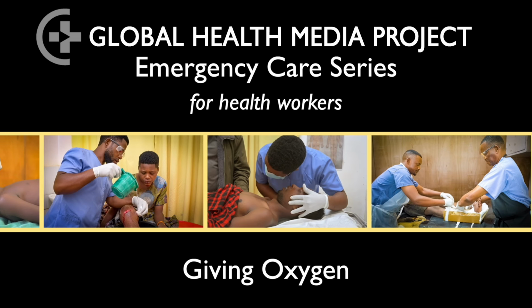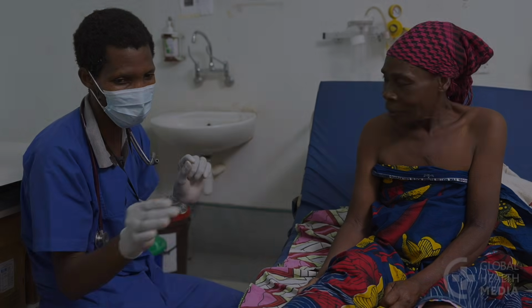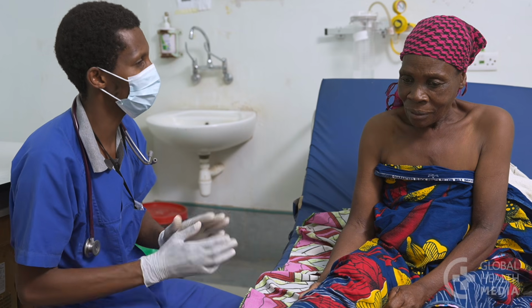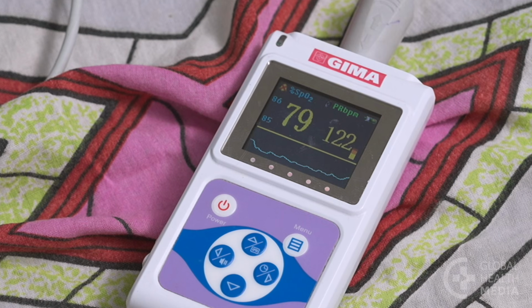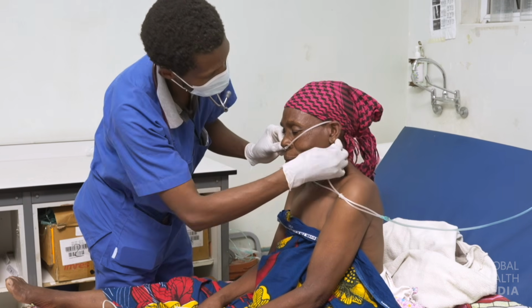Giving oxygen. This video shows how to determine whether a patient needs oxygen and how to give it.